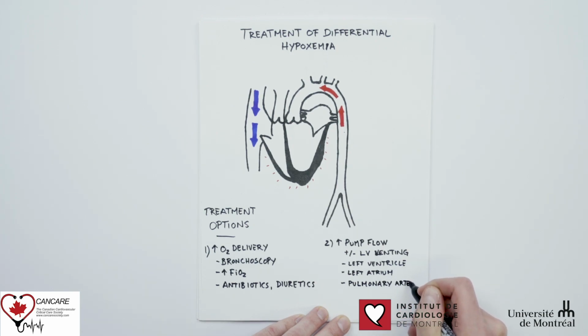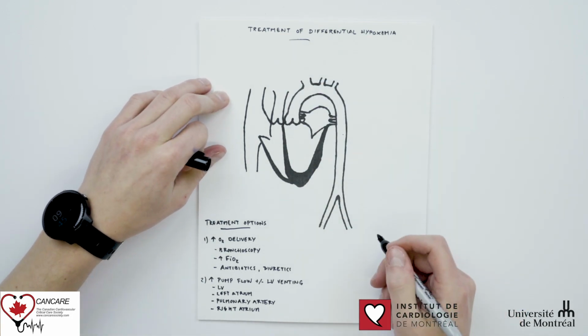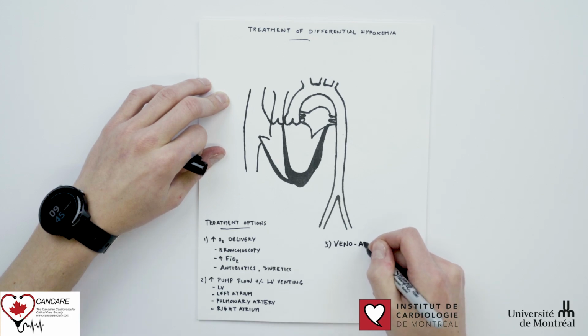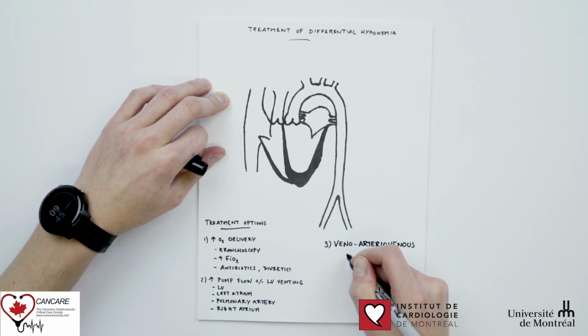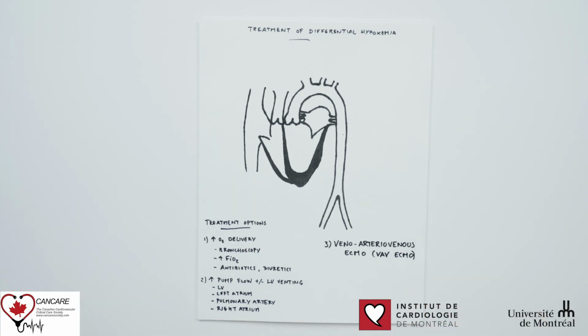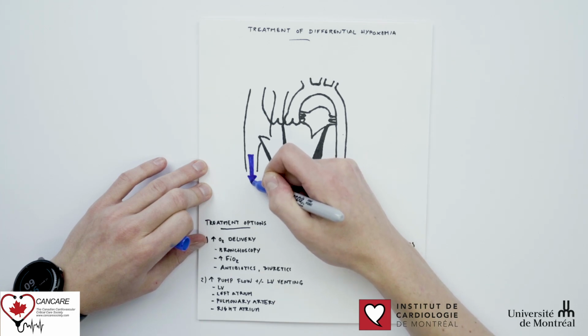Concomitantly, a gradual decrease in inotropic support can be attempted in order to decrease the amount of blood pumped by the left ventricle. Finally, the blood saturation in the left ventricle can be increased using a venous reperfusion cannula installed in the superior vena cava. This configuration is known as Veno-Arterial-Venous ECMO and requires the installation of a Y connector on the outflow cannula.